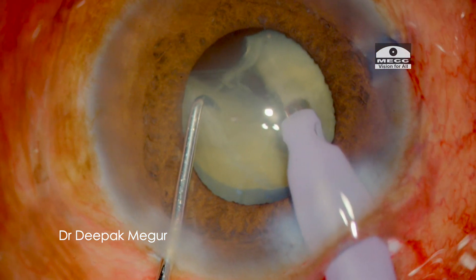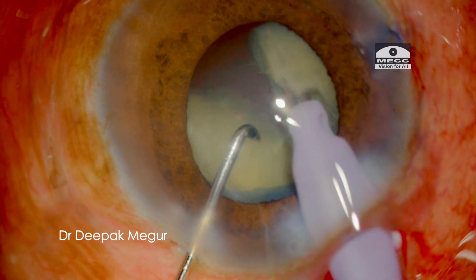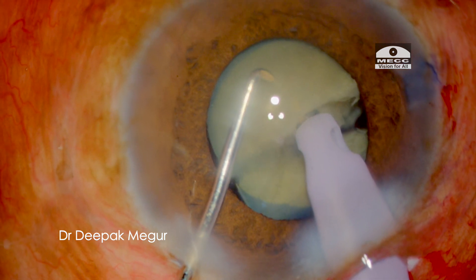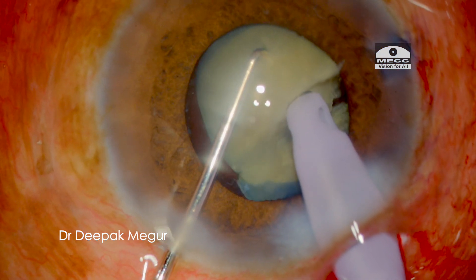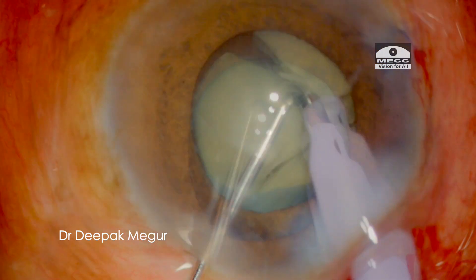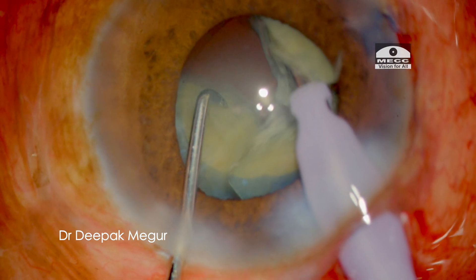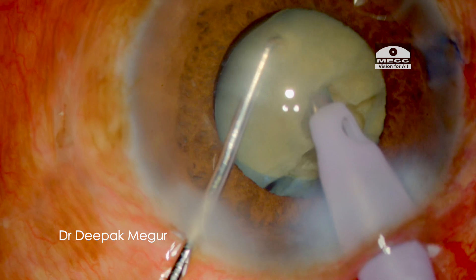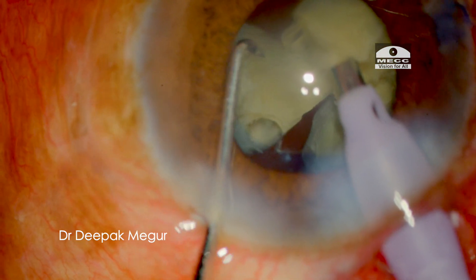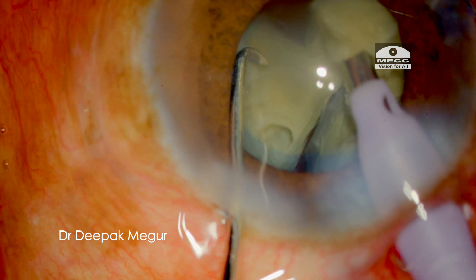Care is taken during chopping and lateral separation that stress is not imparted on the zonules. The posterior plate is not completely separated. Moving on to the next heminucleus — the tip is buried nice and deep this time, and since I could get a very firm grip the chop is better. Moving on to the next chop, I can see that the grip is not firm as the tip is more superficially buried, so the chop is not efficient and not through and through.